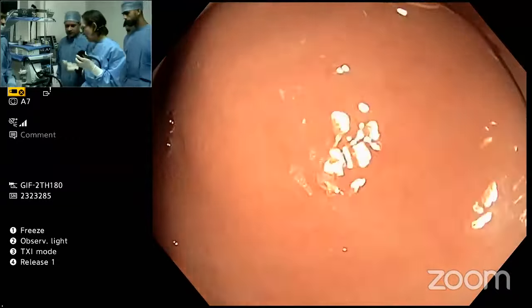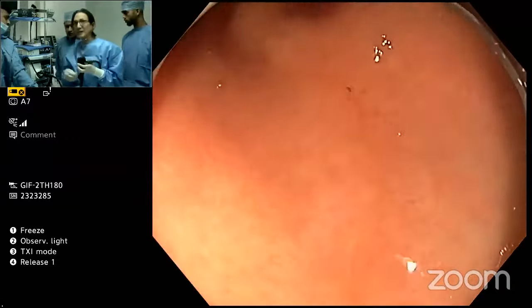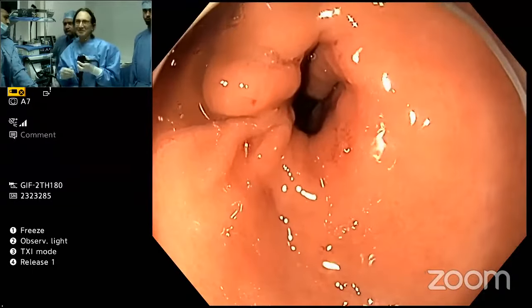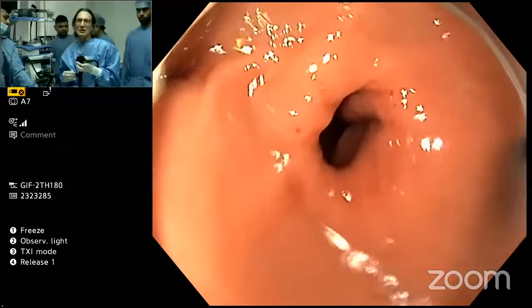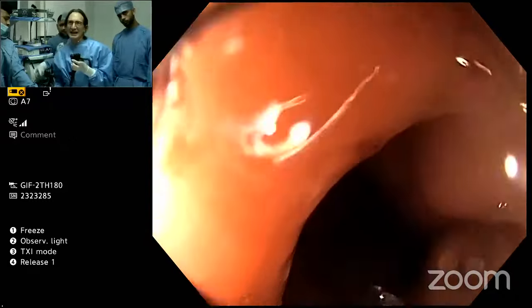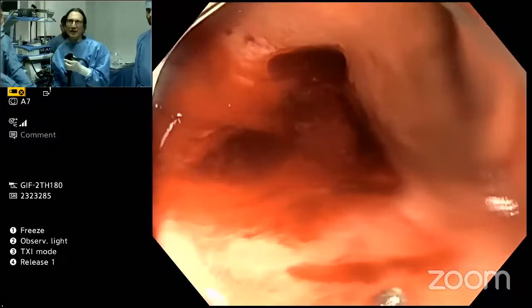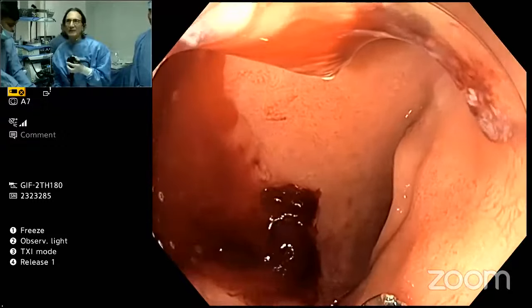So good. All right. Now here's the clip. What kind of clip is this? 16? Okay, so let's see if we can do this. Might be a little bit tangential, and the stalk's a little floppy, but let me get into position. By the way, if you work in the bulb, you have to have a cap on. Otherwise, there's just no way. Even with a cap, it tends to flop back and forth.